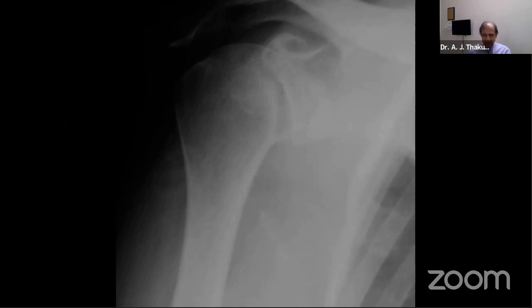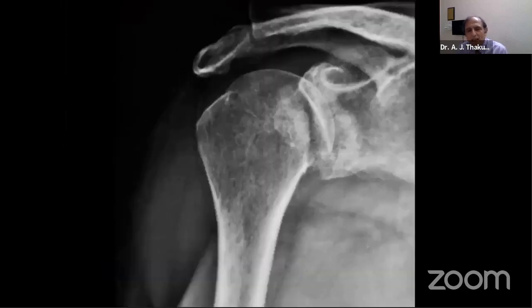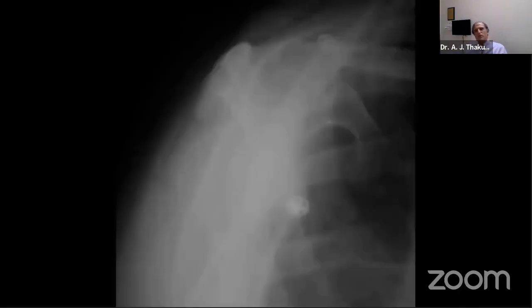She was asked to come to the fracture clinic, and there probably some junior doctors saw the same X-ray, in a slightly better position. And they said, "Okay, nothing. Go for physiotherapy. Come back after 2 weeks, 2 months. You will be fine." After 2 months, I think the consultant saw her and then realized that this has not helped. So he asked for a lateral, and the thing was extremely clear that the head is dislocated posteriorly.